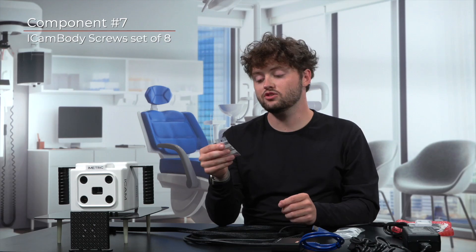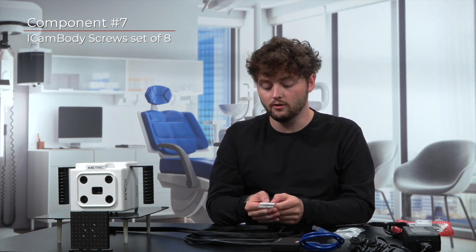Close to your iCam bodies, you will also find a set of screws in a plastic bag. These screws will be labeled 1.4 millimeter short or 1.4 millimeter long. Functionally, the iCam body screws have a straightforward role: they are the screws that you will use to fix your iCam bodies onto the patient's MUAs before proceeding with the measurement.